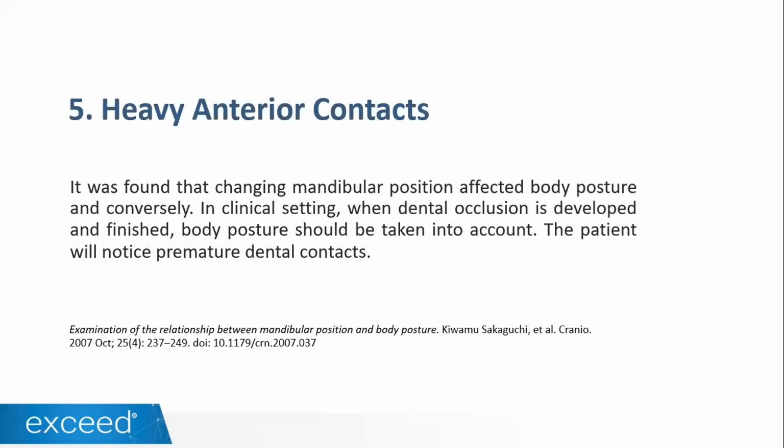Then you have a second cause. And for me, this is really important. And this is how we take the bite registration.